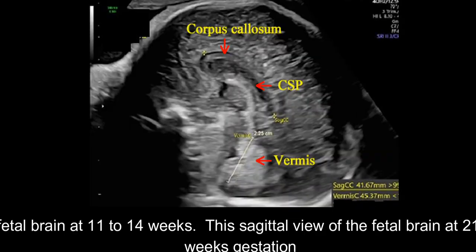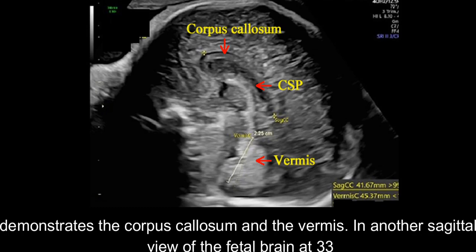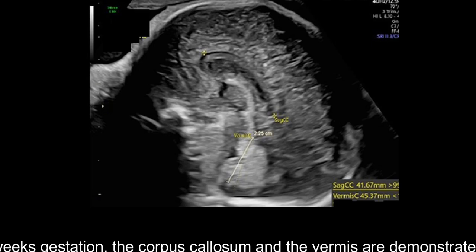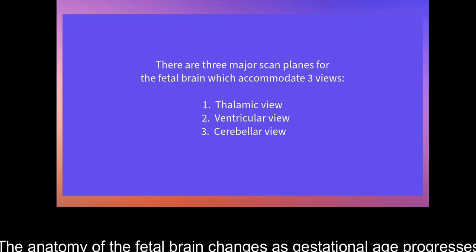This sagittal view of the fetal brain at 21 weeks' gestation demonstrates the corpus callosum and the vermis. In another sagittal view of the fetal brain at 33 weeks' gestation, the corpus callosum and the vermis are demonstrated. The anatomy of the fetal brain changes as gestational age progresses.